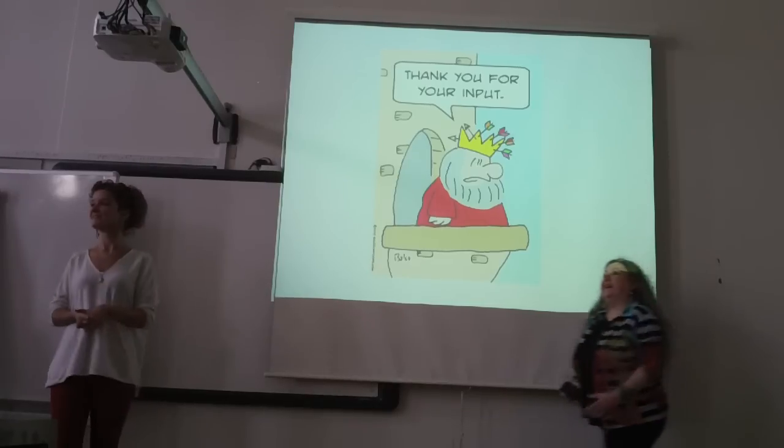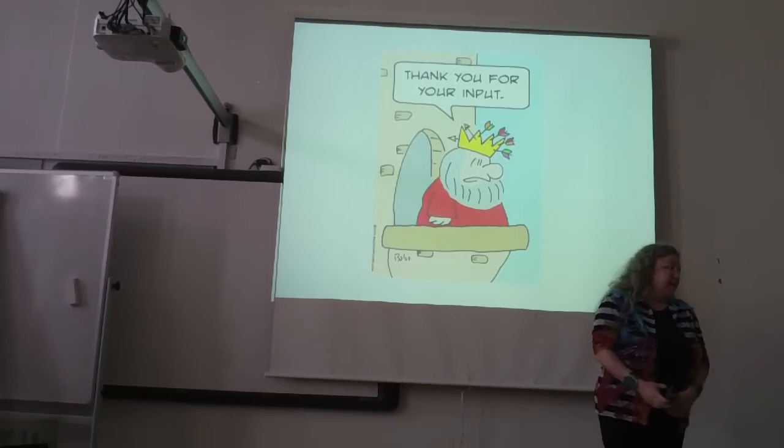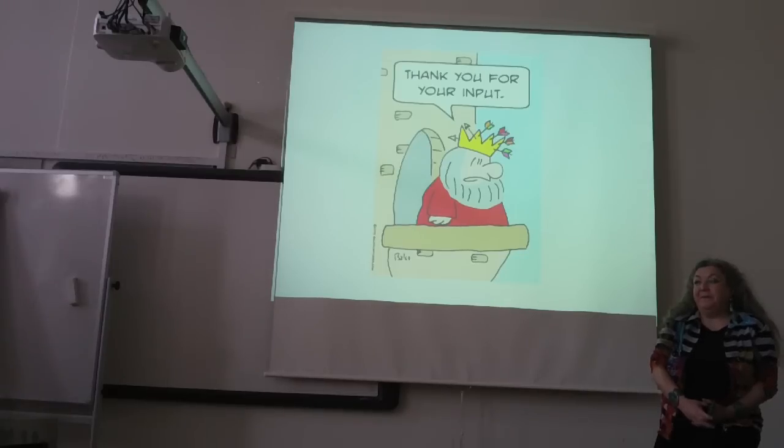Were there any theories as to why some people may have different types of flageolet closure? Sorry, I didn't hear the beginning of your question. Were there any theories as to why? No theories. We just asked them to freewheel, and this is what I saw on the footage, so this is what I present, and I'm like, what the hell is happening? What is flageolet?